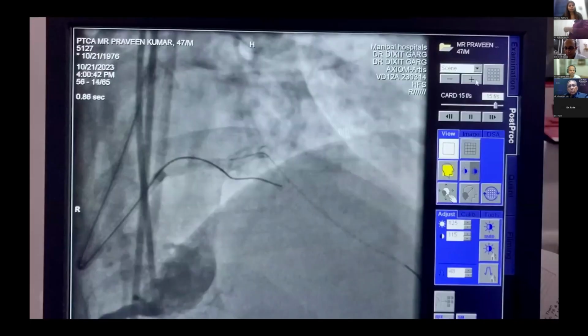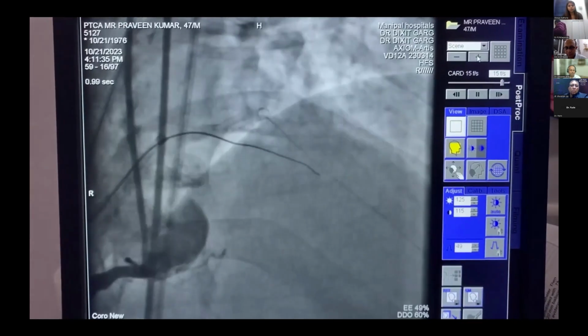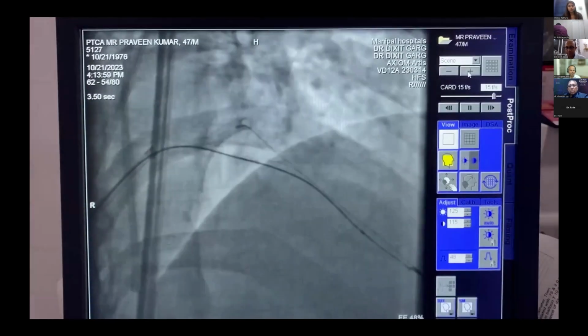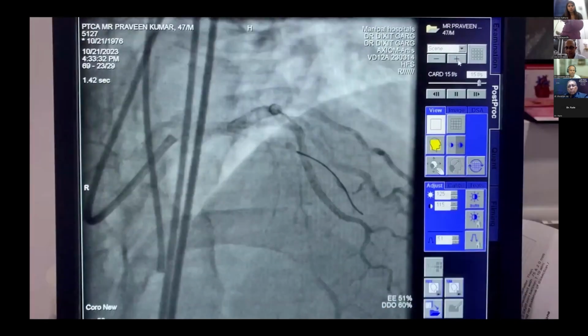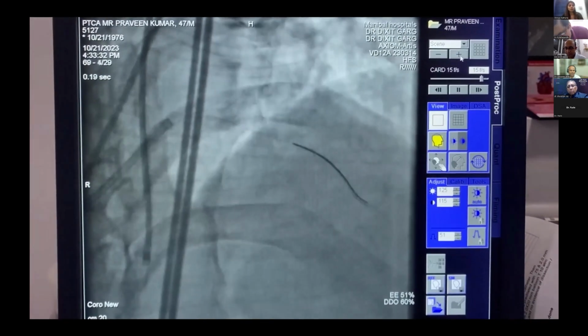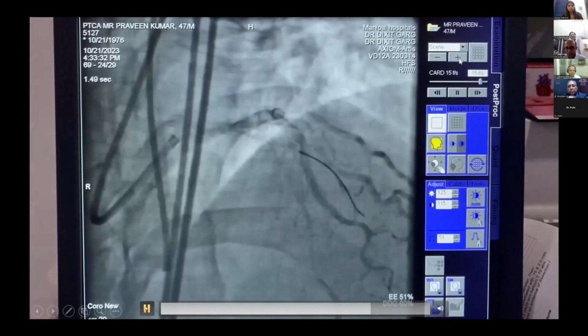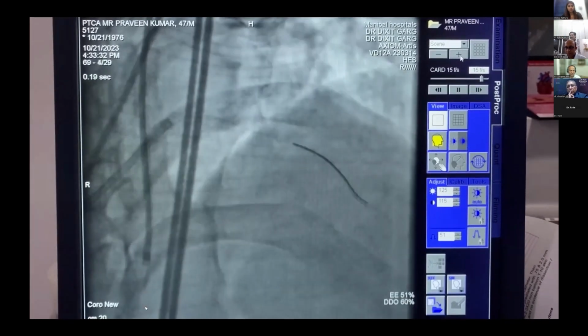So it is a good strategy to stent across the bridge in some selected cases. Only a question, as Suvarna sir has told, that as long as things go well according to plan, then everything is fine. But in CTO intervention and complex cases, we need to plan for our plan not going according to our plan. So in some cases, what is the backup strategy?